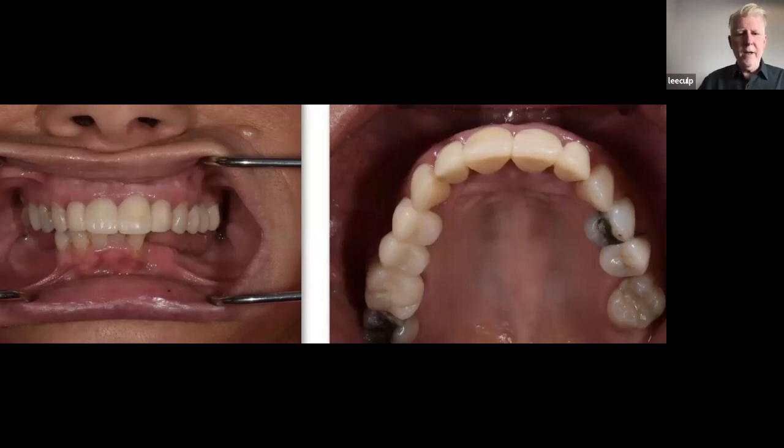So there's two ways to reduce bone. And I think John and I agree that there's a whole lot more bone reduction going on than probably needs to be. One of the things digital allows us, because we get these cases in, bone reduction, bone reduction, bone reduction, and they're exciting, they're fun, they're really cool cases.